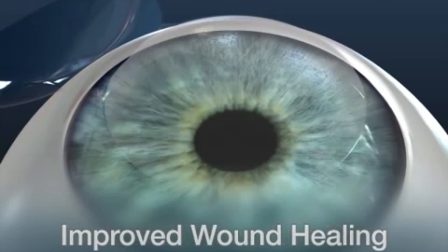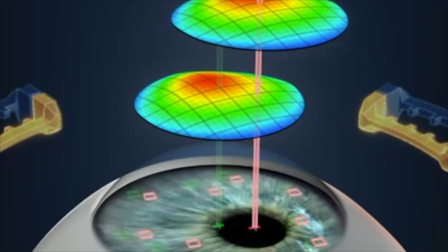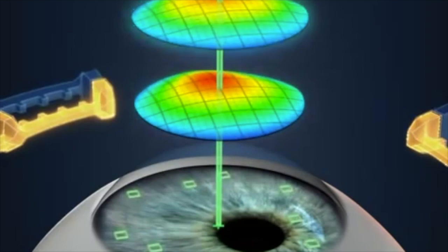In the third step, the patient's wavefront-guided treatment profile is aligned under the laser using iris registration. Often pupils constrict asymmetrically while under the laser, resulting in a pupil centroid shift. Further, the eye can cyclorotate, rotation around the z-axis, when the patient moves from a sitting position to a supine position. Both pupil centroid shift and cyclorotation can result in treatment misalignment and suboptimal results. By engaging iris registration before treatment, these phenomena can both be overcome.